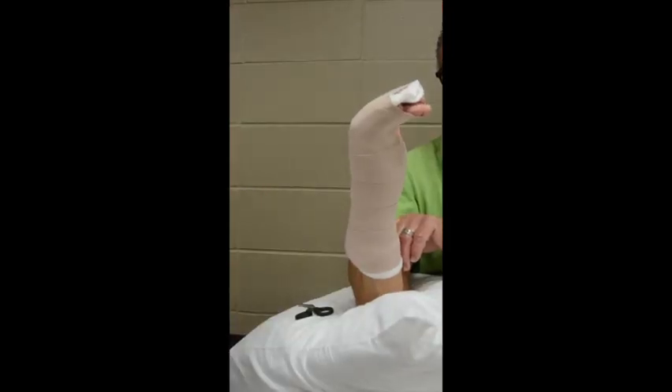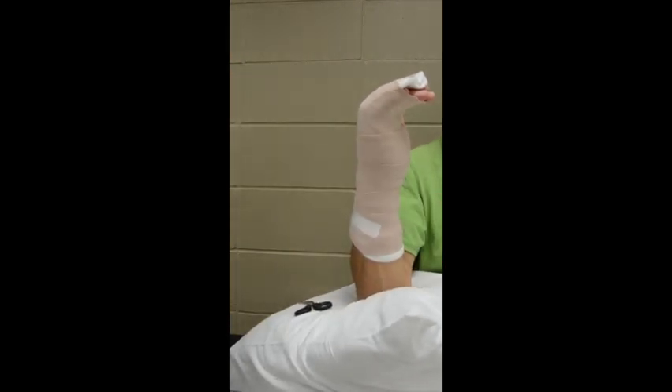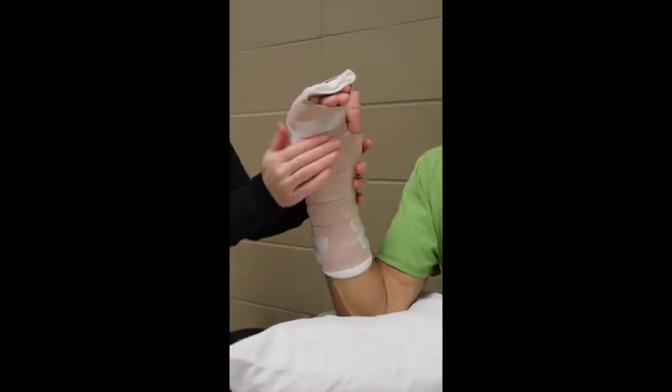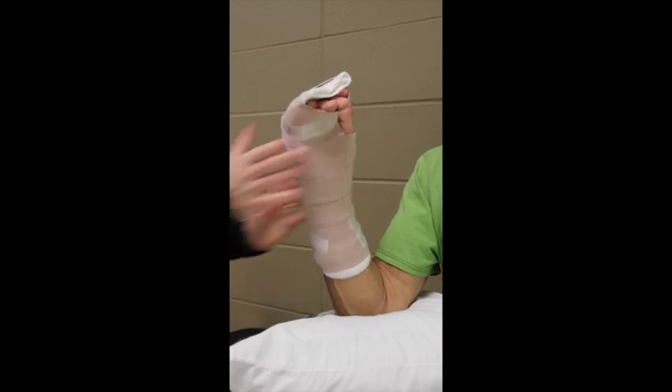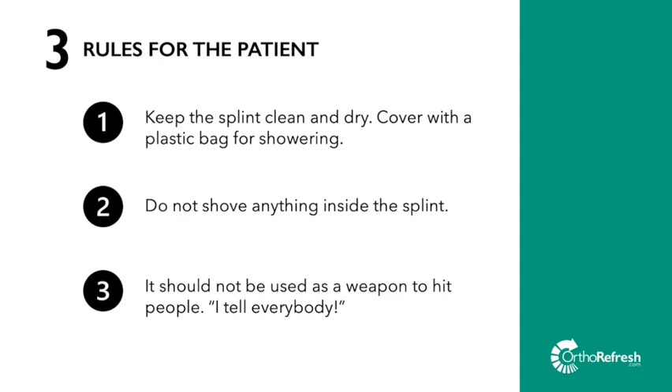Maybe use the patient to help hold the elastic bandage while you get your tape — they're usually pretty helpful. You can also use additional tape around the distal edge of the splint to hold all the corners and edges of the elastic bandage in place. I call this tape art. This is the final dorsal blocking splint. Then go over the three main rules with the patient regarding splint care. In addition to these rules, I encourage the patient to keep the hand elevated to the level of the heart or higher as much as possible and use an ice or cold pack in the armpit.